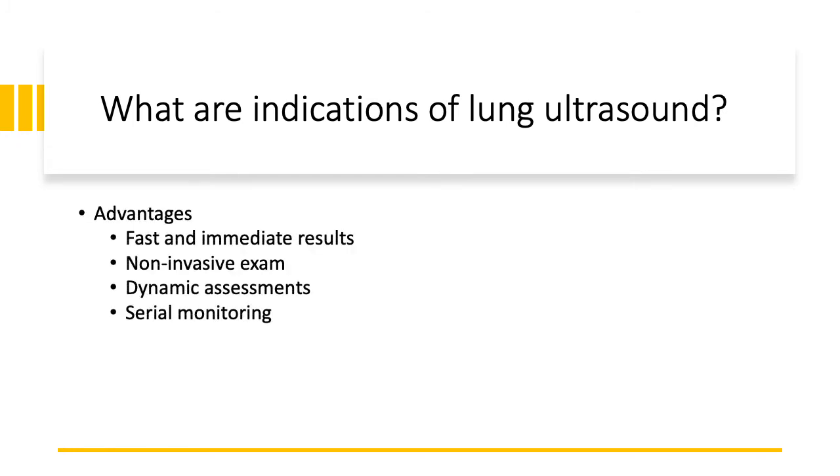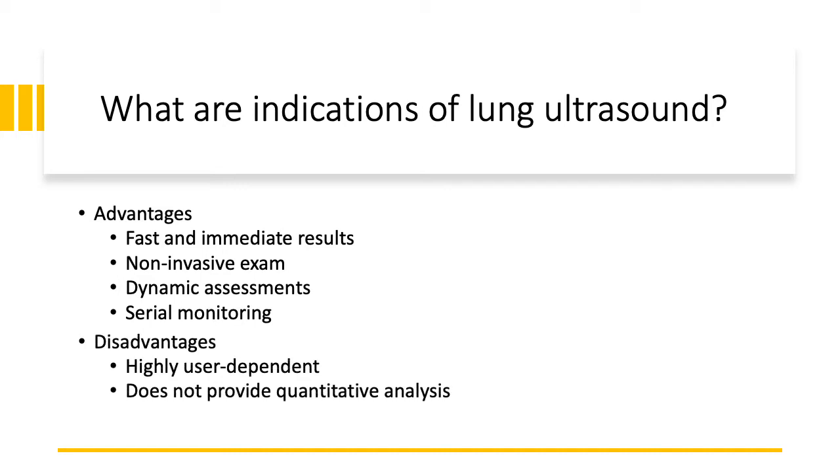So advantages of lung ultrasound are that it provides fast and immediate results. It's a non-invasive exam, meaning it causes minimal discomfort to the patient. It can be used for dynamic assessments and serial monitoring. Disadvantages are that it's highly user-dependent, meaning that if the operator is a novice, they may not get the best images or the most accurate exams, and it does not provide any quantitative analysis.